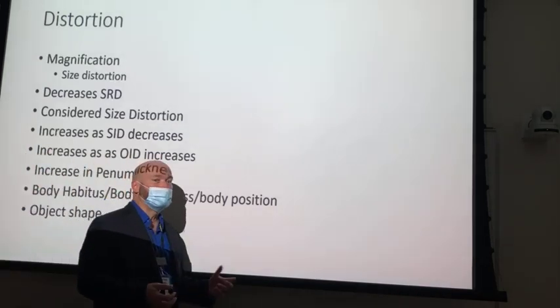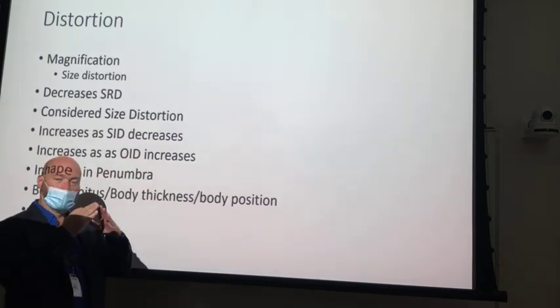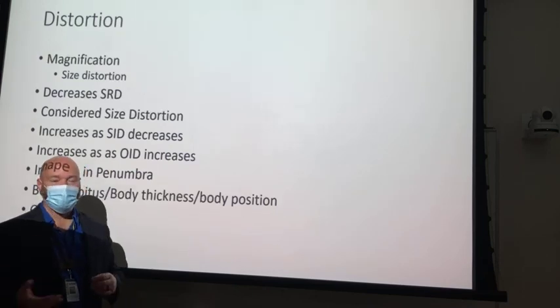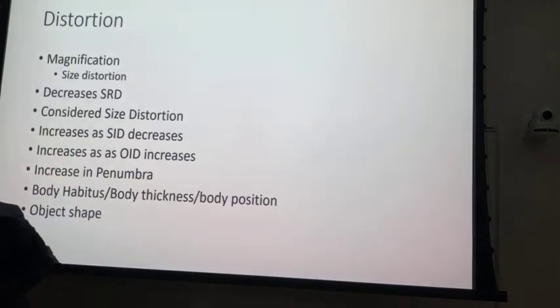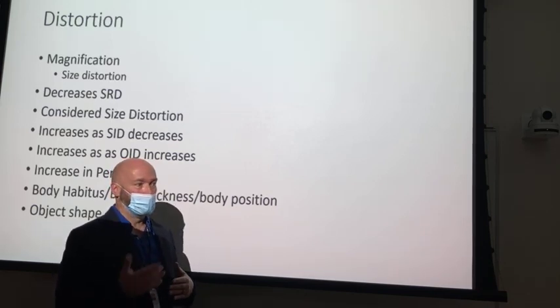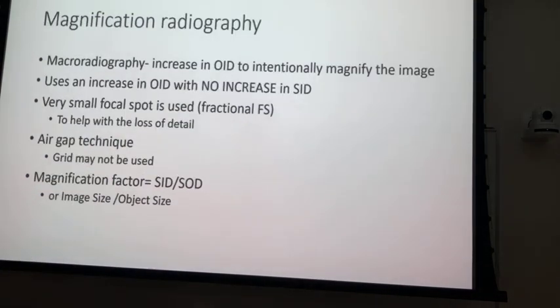We talked about wrists. Which projection do we shoot wrists? PA, right. We said, though, that the wrists are cone-shaped with the anterior surface more pointy than the posterior surface, right? Again, it's another thing I've never really understood. So if the anterior surface is more pointy and the posterior surface is fatter, then which projection would actually be better to shoot your wrist? Would it be AP or PA? Really, AP, right. Why do we do PA? Your guess is as good as mine.